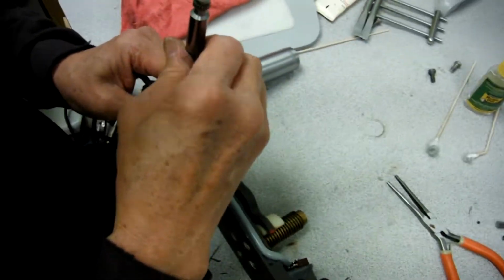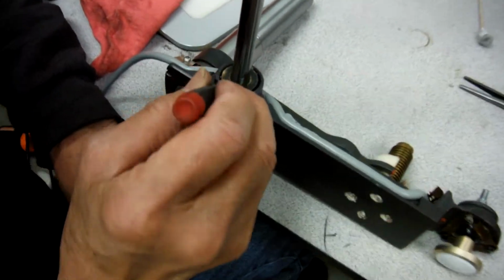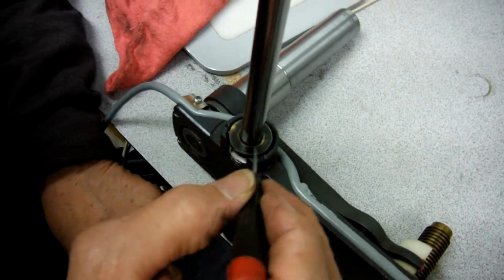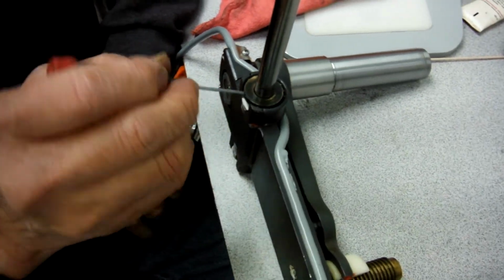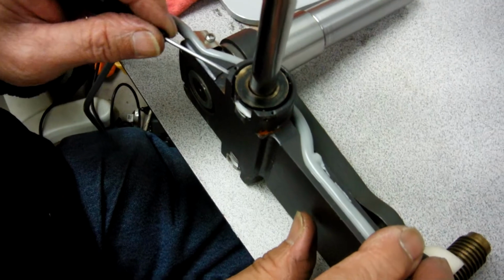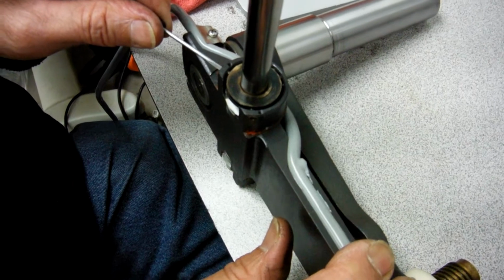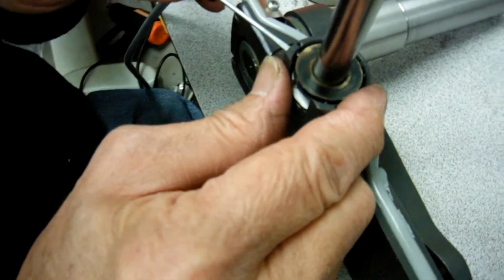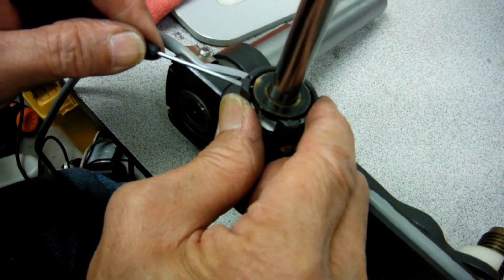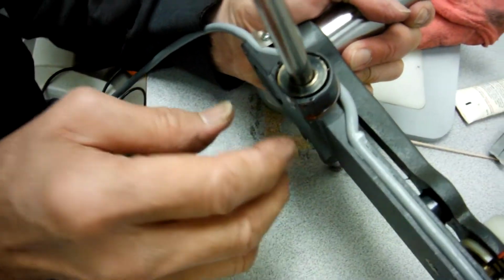Okay, after you got the shaft in there, now you can see it around. Now you can see where it is high or where it is tight, and then you can adjust these two screws. It looks like this one in here touches the shaft and this one in here is open. So what I do is run the screw on this side in to get it even. See, right now it seems to be evenly around, and you can do that with your naked eye and see what needs to be adjusted.